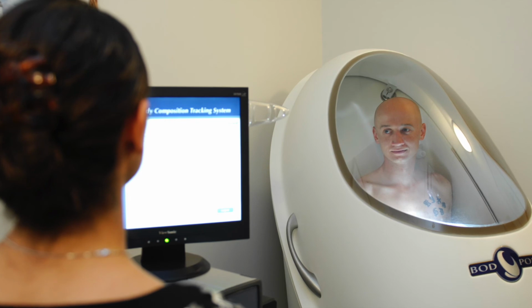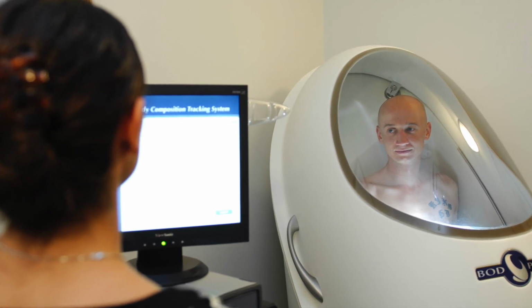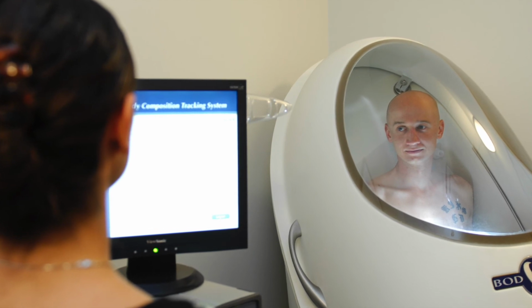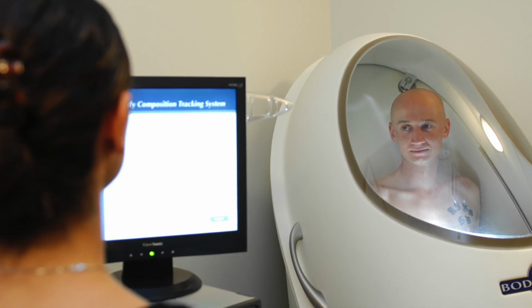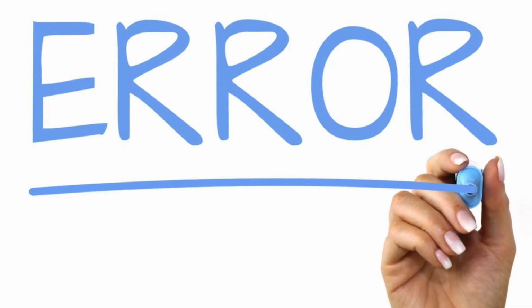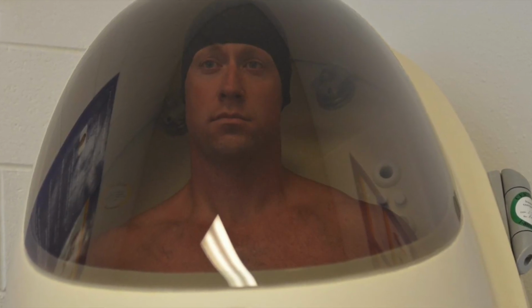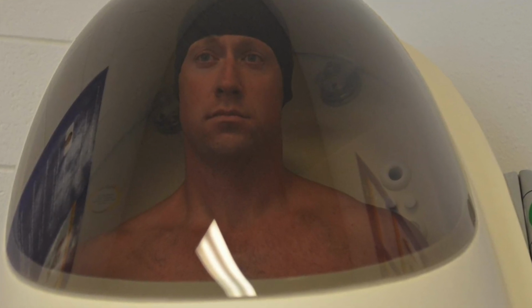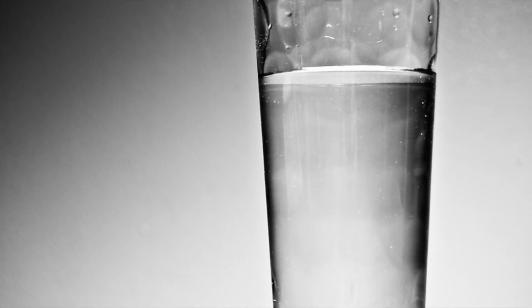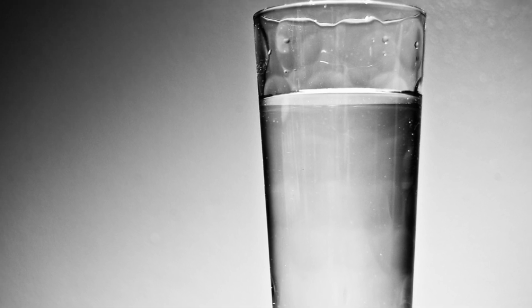However, it does have some limitations. The commercial BodPod unit is very expensive and ranges in price from $30,000 to $40,000, making it only available to certain facilities. In addition, the manufacturers indicate the general error range of the BodPod is 1 to 2%. In regards to patient-specific limitations, the subject should not have exercised for 2 hours before the test, as hydration status and increases in muscle temperature can adversely affect the results.